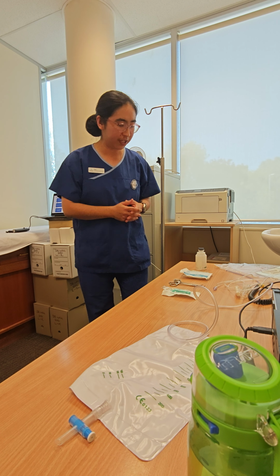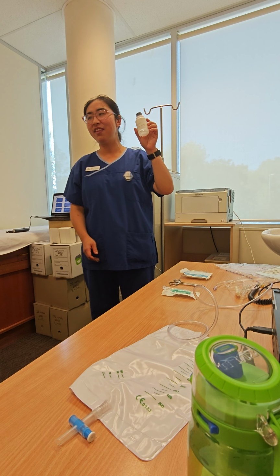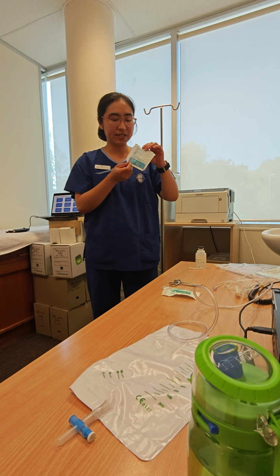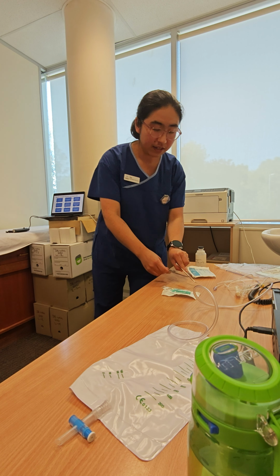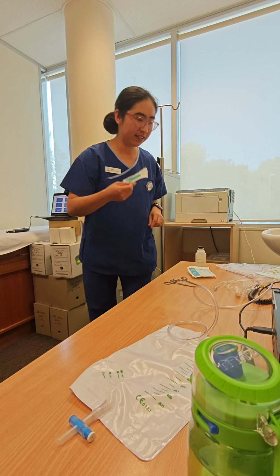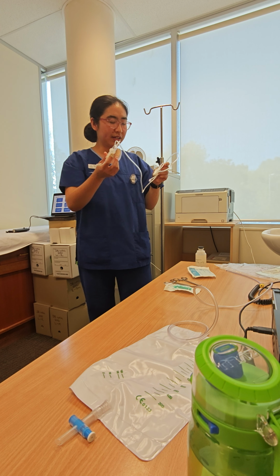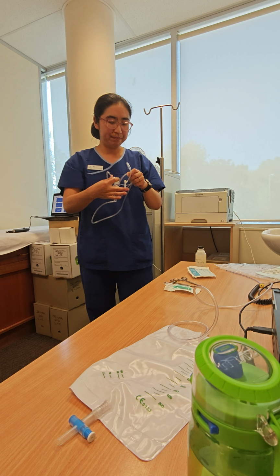So what do we have for this cystogram? We're going to bring 100 ml contrast, a new one. It's just for display. A needle, a new needle, and sterile gauze, a new one as well. Two surgical clamps, and one catheter connector. We also call this a Christmas tree. And this one is an infusion set, which is going to connect our contrast to the catheter.